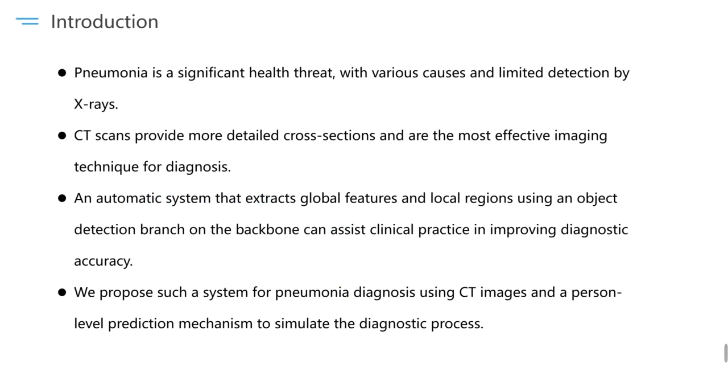Pneumonia, particularly viral pneumonia with high transmissibility, poses a threat to human health. The main causes of pneumonia are viruses, bacteria, fungi, and mycoplasma, and the clinical manifestations and imaging characteristics of different types vary. Chest X-ray is limited in detecting lesions, while CT scan provides more detailed cross-sections.